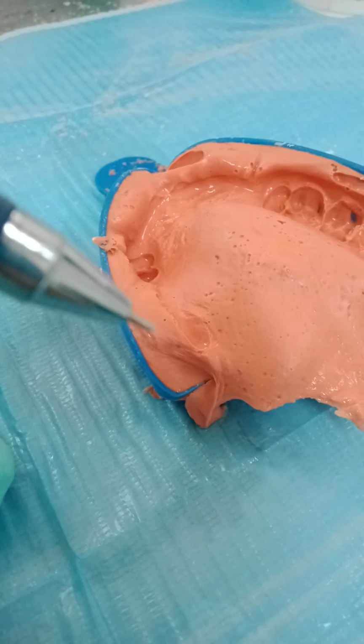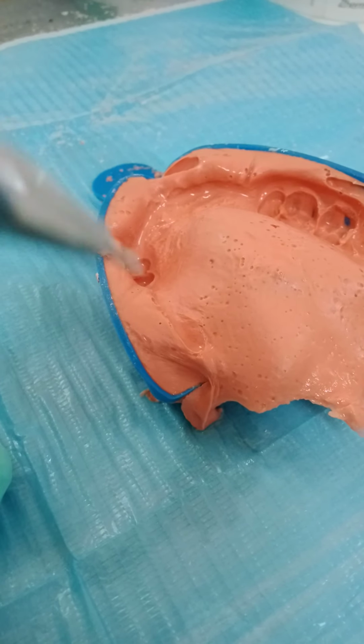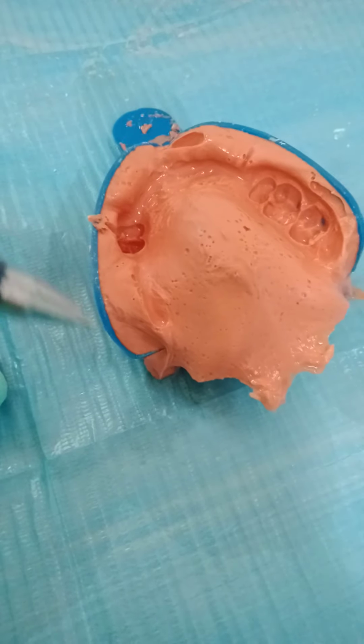Here is how I'm going to judge your impression. I need to make sure that you have recorded this correctly. I'm going to measure it with my finger and check if you've taken it correctly. If you have not, you're going to repeat, or do a special tray. Sometimes we're limited with our trays.